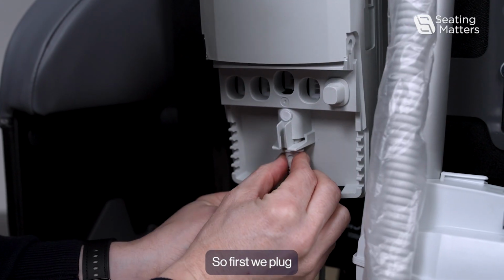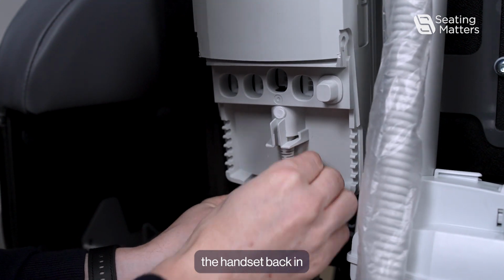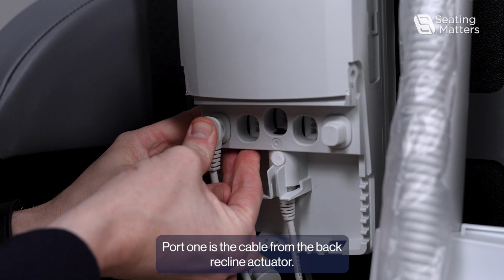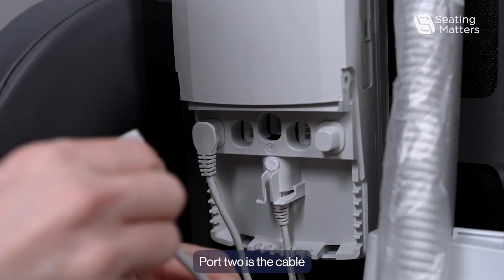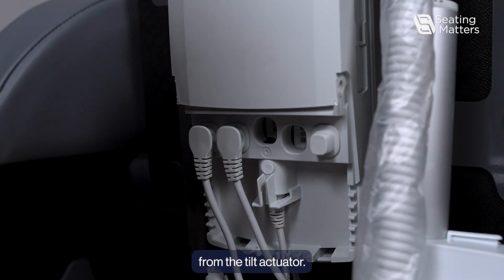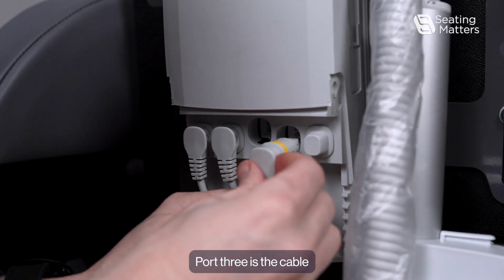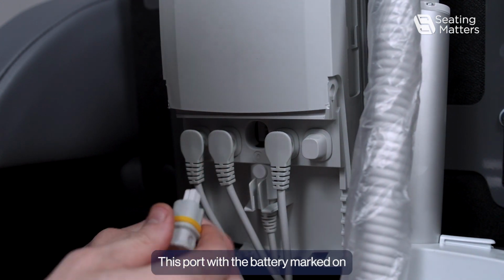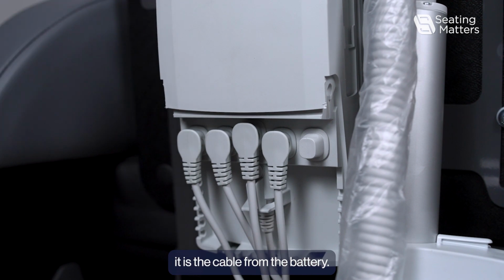So first we plug the handset back in. Port 1 is the cable from the back recline actuator. Port 2 is the cable from the tilt actuator. Port 3 is the cable from the leg elevation actuator. This port with the battery marked on it is the cable from the battery.